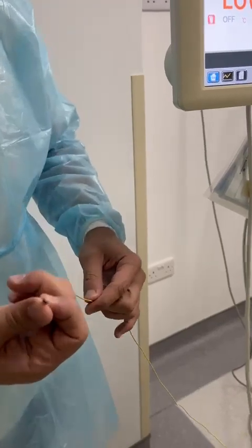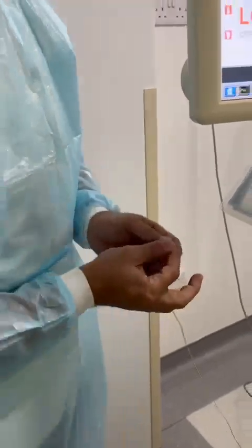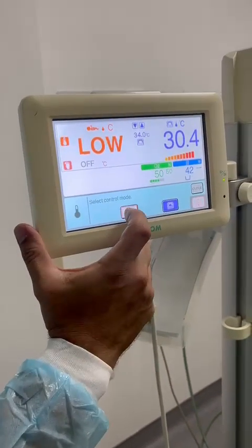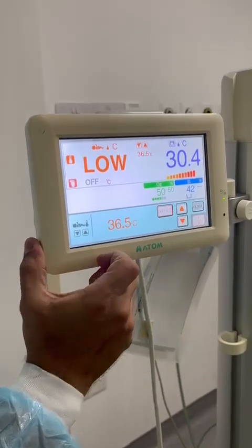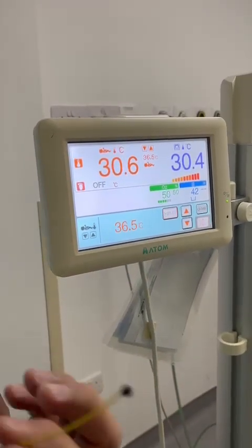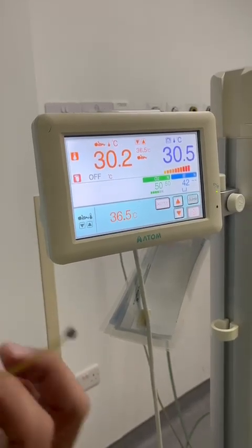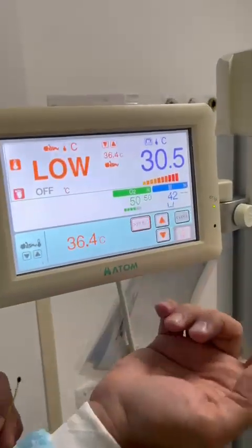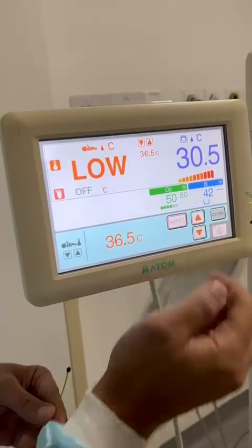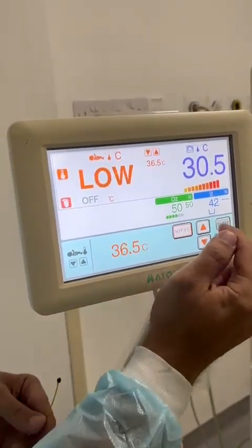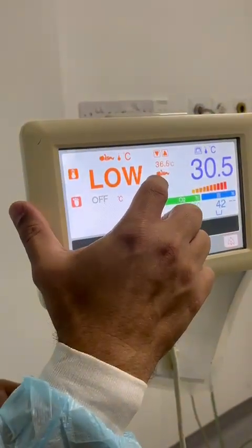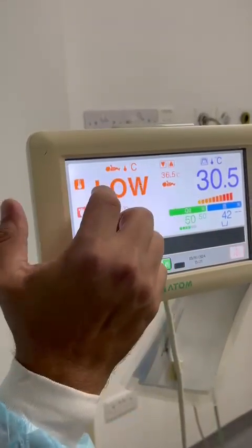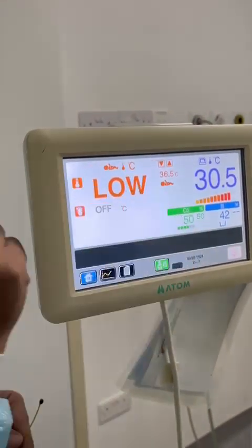For skin control mode, we need to connect the sensor to the baby's abdomen — exactly to that area — and then switch to skin control mode. In the skin control mode, we select baby temperature. Suppose we want baby temperature to be 36.5 degrees. You can see the indicator has changed and the color is matching here, so that means we are working in the skin mode.